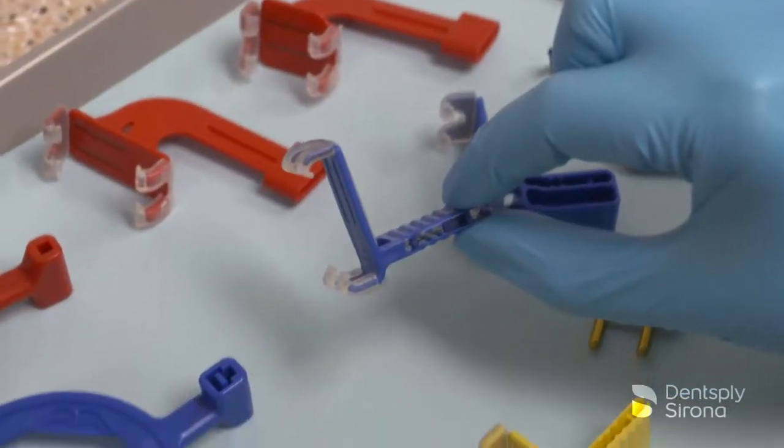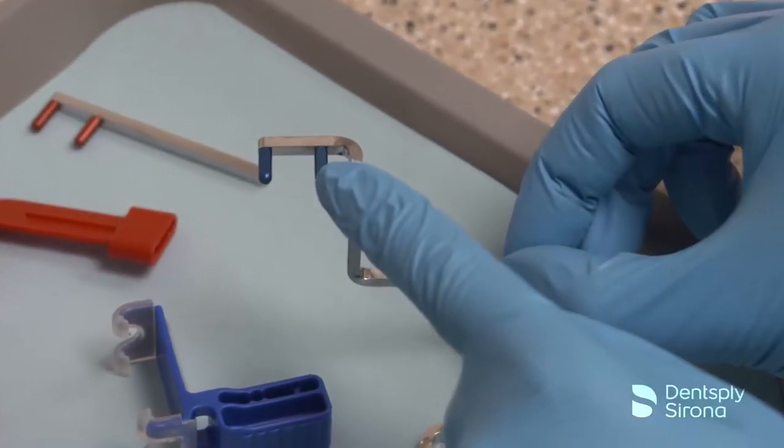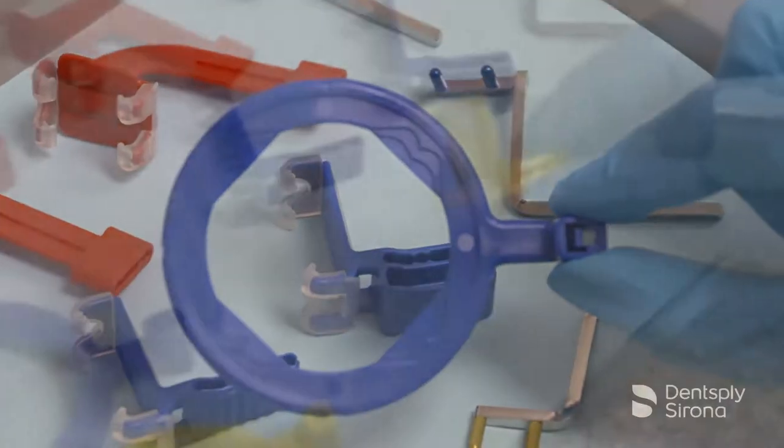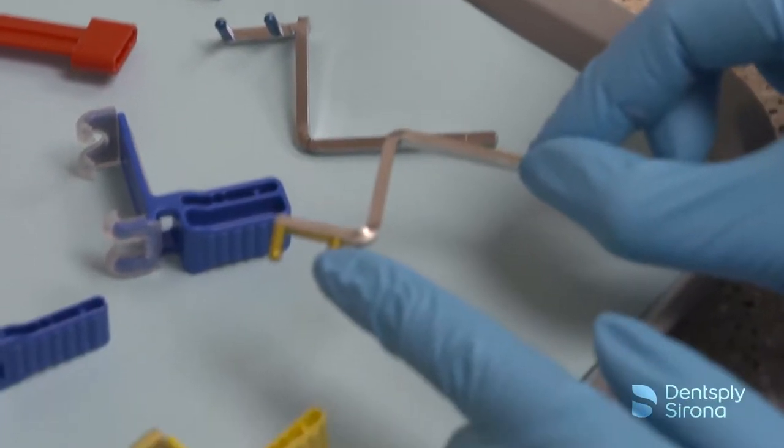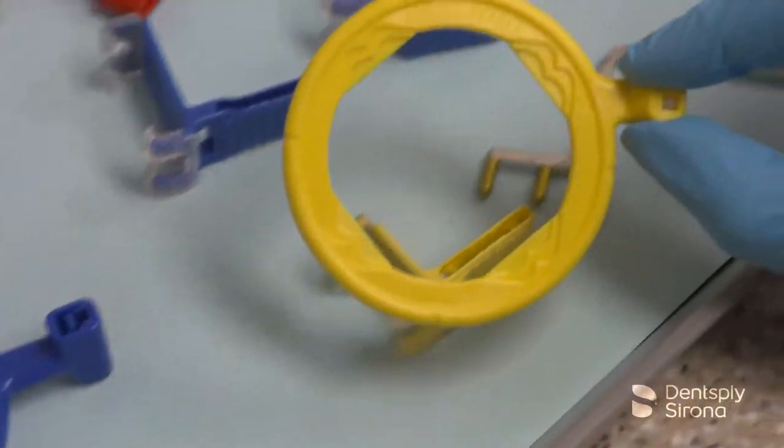The blue bite blocks correspond with the metal arm with the blue pegs and the blue ring. The yellow bite block is for posterior periapical radiographs and corresponds with the metal arm with the yellow pegs and the yellow ring.